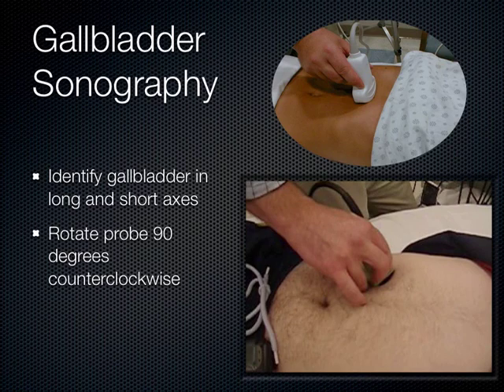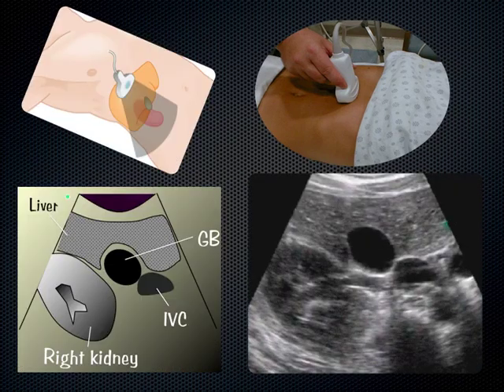So, once you go to the short axis from the long axis, this is what you see. You see things start to look like circles, and the kidney looks more round in the short axis. Remember, the indicator is the patient's right. There's this circle here, there's this circle here, we see another circle over here. Basically what we're looking at, this is the aorta, the IVC, and the gallbladder.